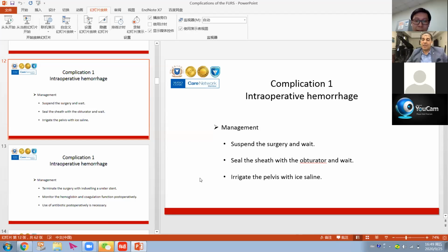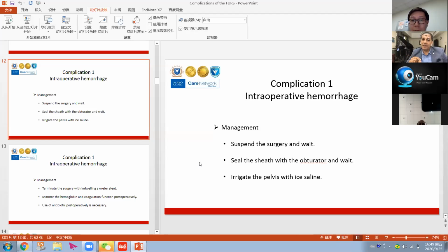Okay. One question again: if you have a clear source of bleeding, do you think that laser coagulation can help to control the bleeding? Sometimes it works, I think, and it relies on the laser machine. I think the better machine is better. So what parameters do you prefer for coagulation? Do you increase the frequency, reduce the power, or which parameters? I think the power should be high, and the frequency should be low for coagulation.